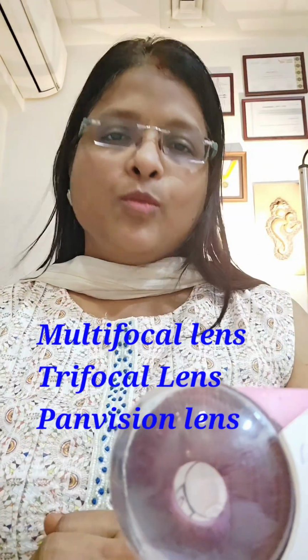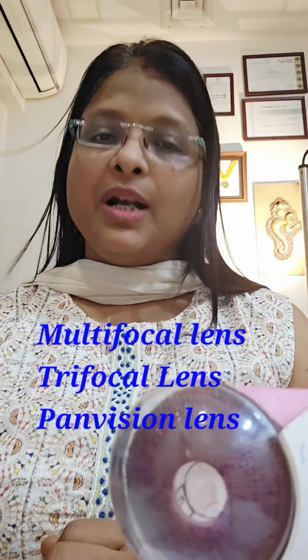Then there's a second type of lens. Many a times people do not want to use glasses. They say we want spectacle-free vision throughout life after removal of cataract. So there are many options for that too. First and foremost option is a multifocal lens. Multifocal lens means multiple foci, that is multiple distances become clear for you. Distance vision, computer vision, TV, near, all these distances, they become clear to you without glasses, about 80 to 90%.